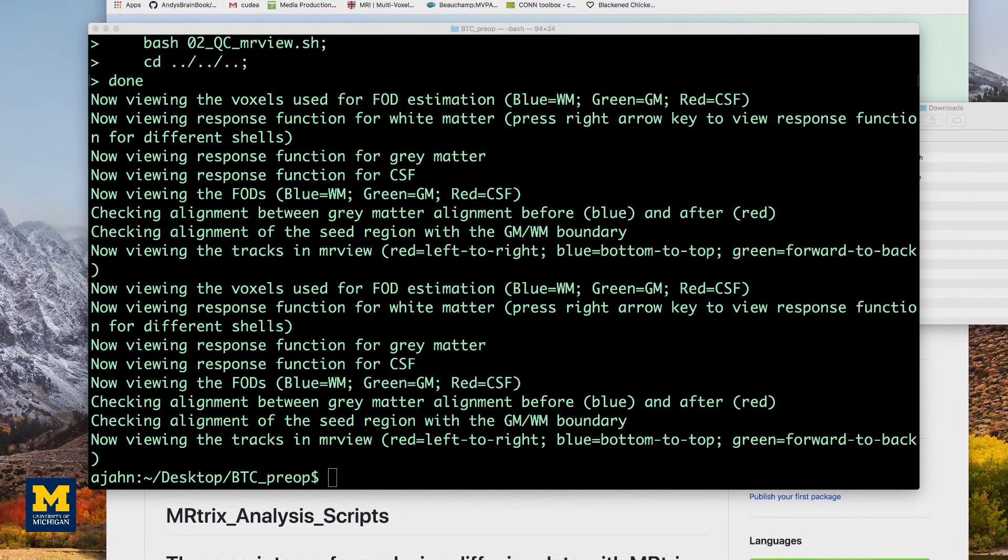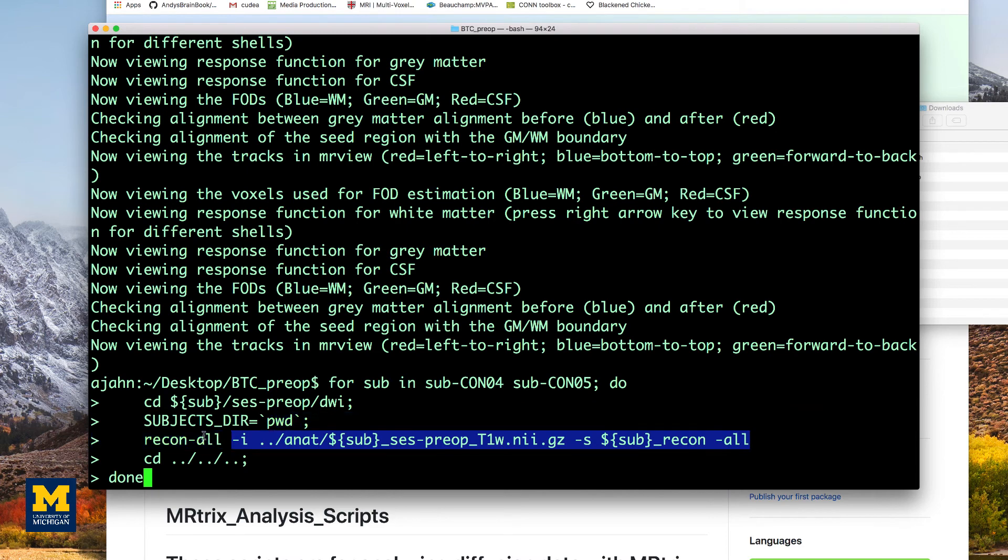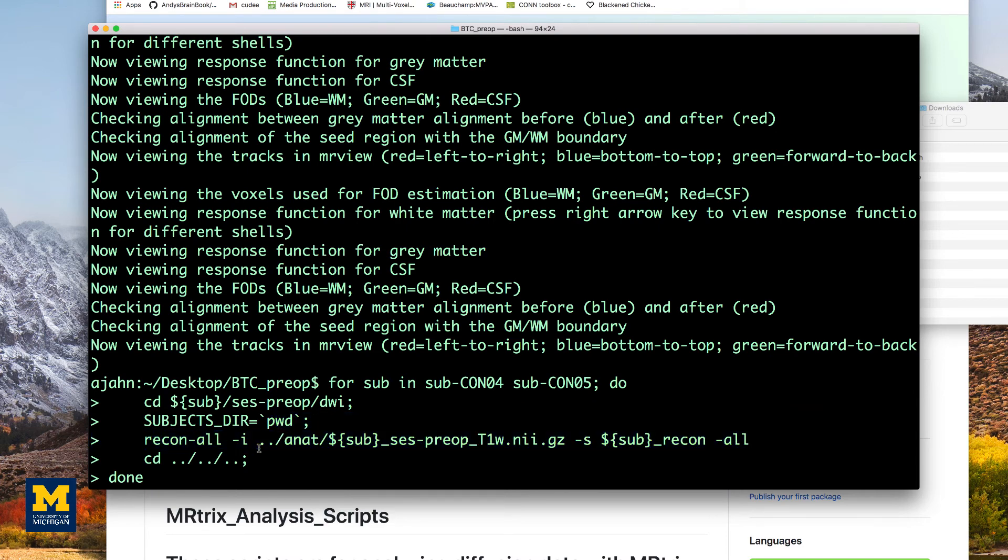Since the command tck2connectome requires the output from recon all, we will execute this in a separate loop. Again, this will take some time, so I'll fade out here until it is done.